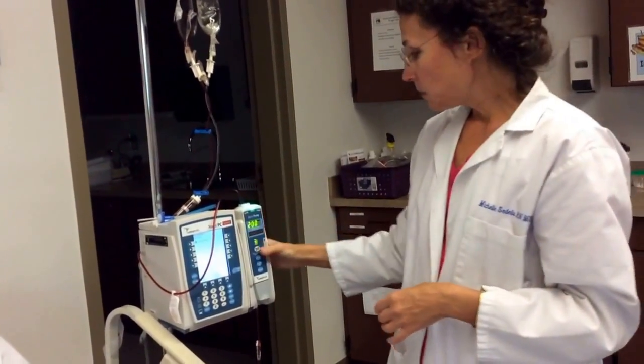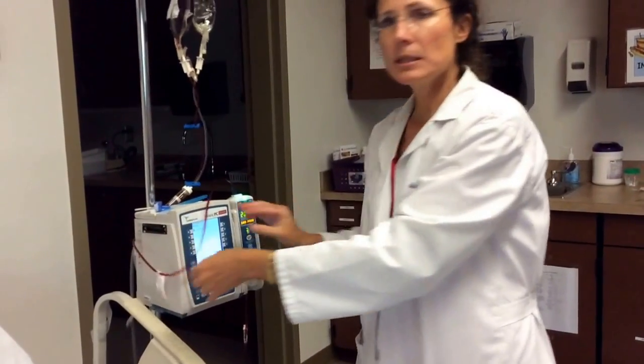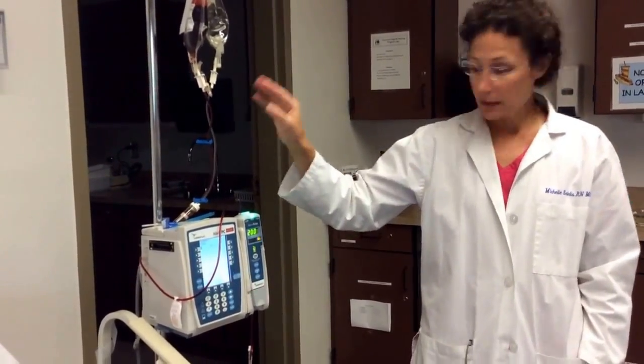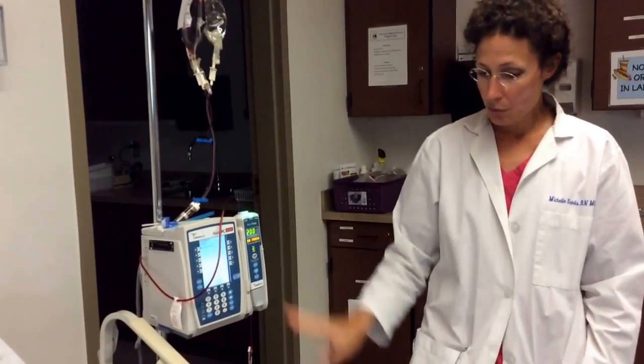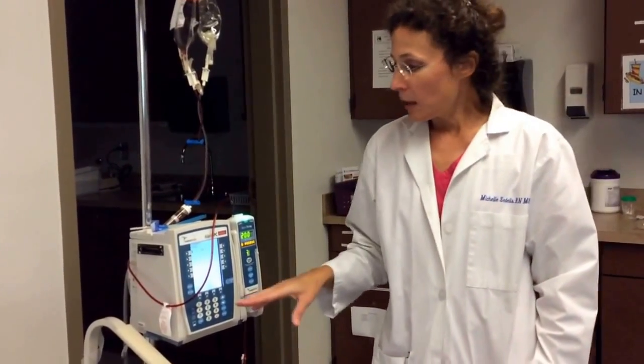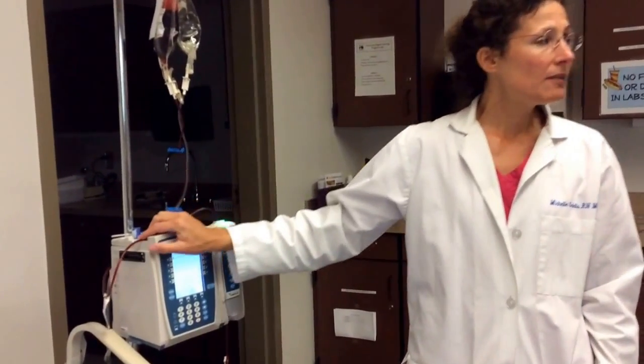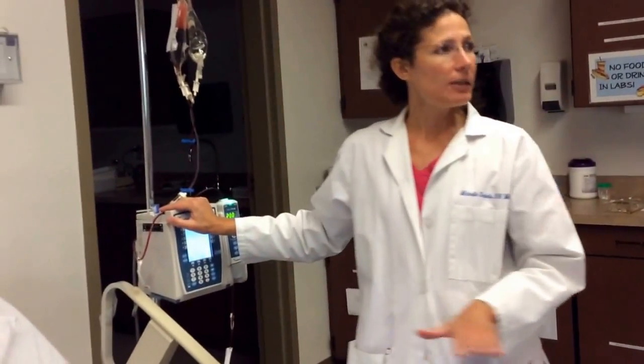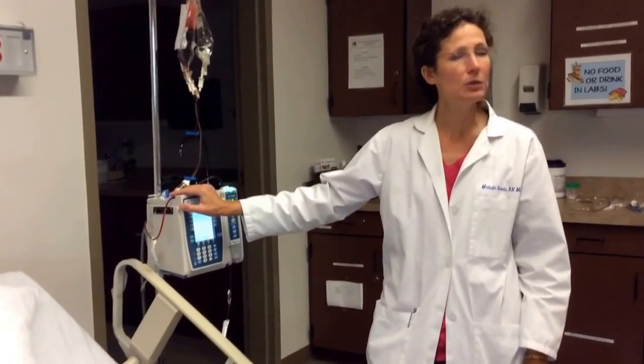If my IV is beeping at this point, I would set it for more volume, okay? So that I can let the blood clear from the tubing so he gets all of the packed red blood cells, okay? At that point, I will do a follow-up set of vital signs, a completion set of vital signs. And again, make sure that Mr. Smith is having no concerns with the blood transfusion.